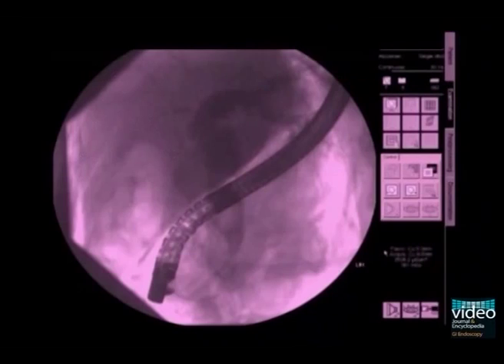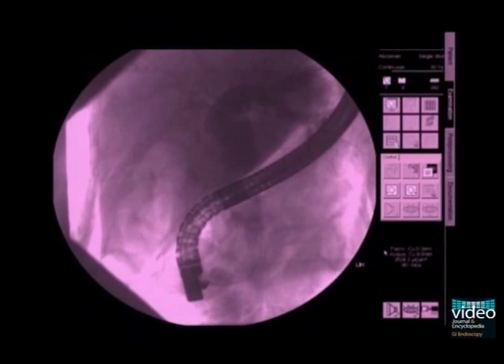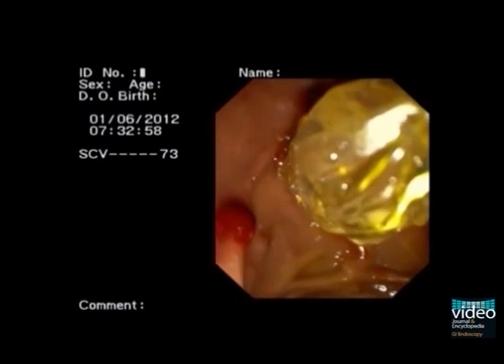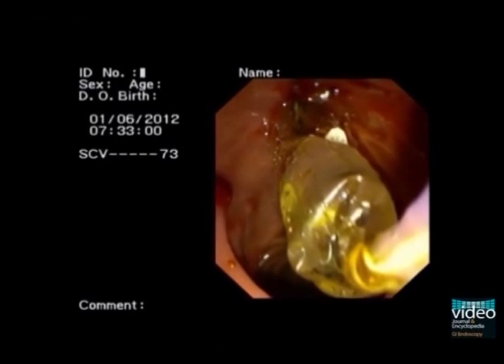Partial dilation of the CRE balloon at a pressure of no more than 10 atmospheres. The largest part of the balloon, approximately 80%, can be seen outside of the ampulla.